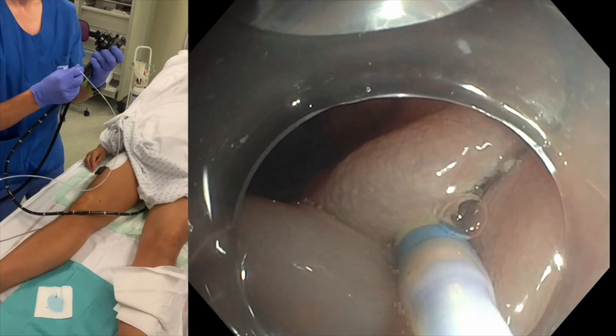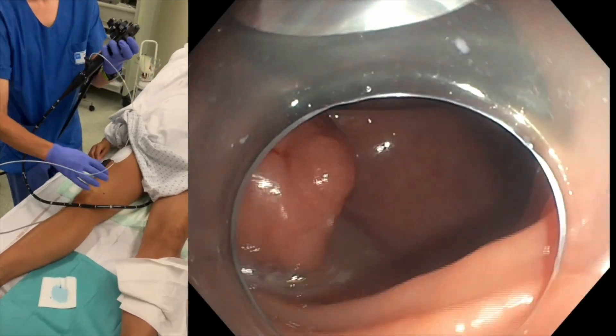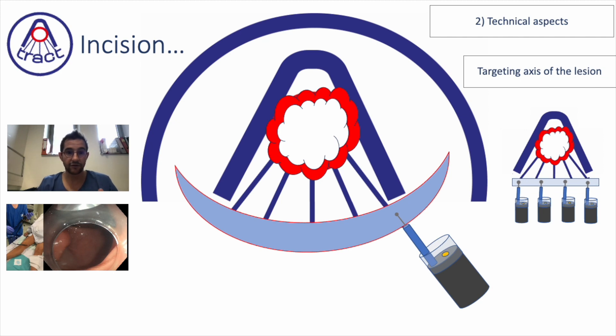The exercise for you is to take a scope, put it in a box stabilized by the box, do this sighting with a lesion and a line going to the center, and try with the scope to always follow the lines, staying parallel to them.